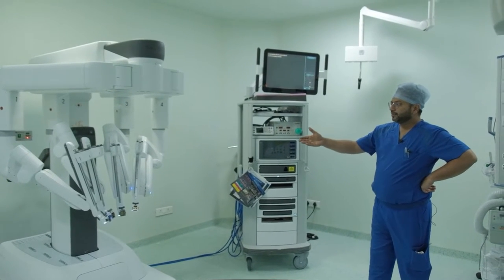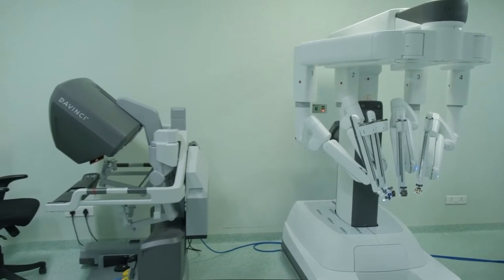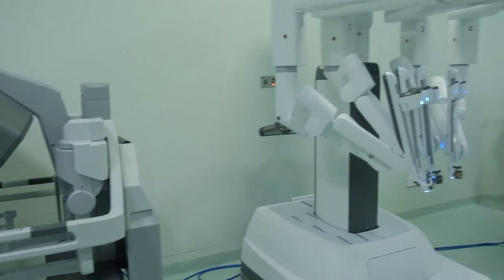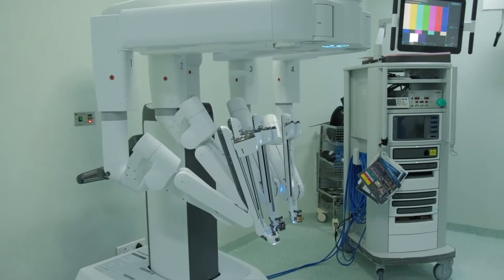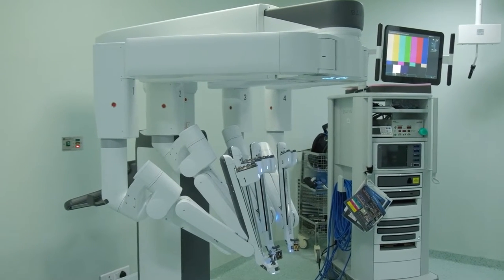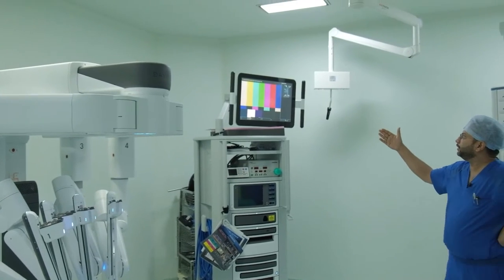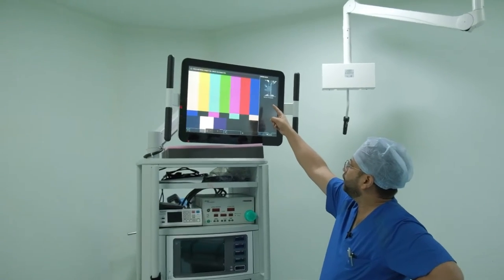Now you can see the patient cart, the lights are getting switched on. Also on the surgeon console, if you can focus and show the movement of the hand controls. The surgeon console was checking the movement of the hand controls, and now the movement of the patient cart arms is being checked, whether they are okay. So we got a message from the surgical system that it is ready. You can see the touch screen here is ready, and we are getting a message, deploy the boom.